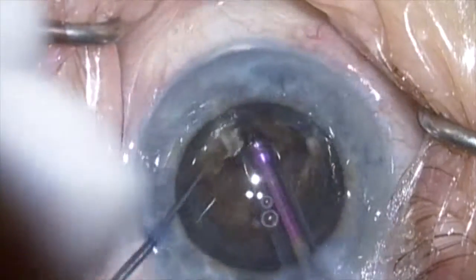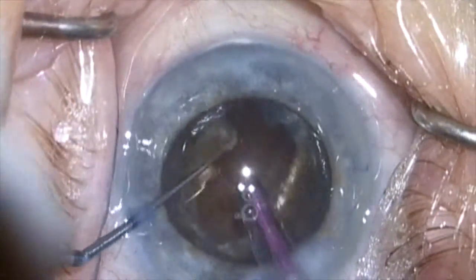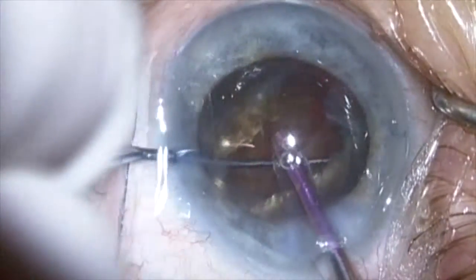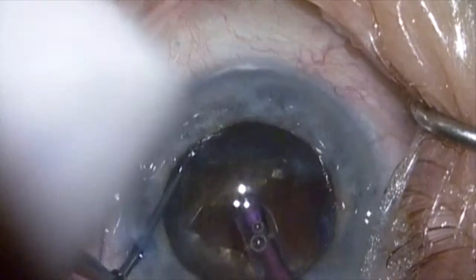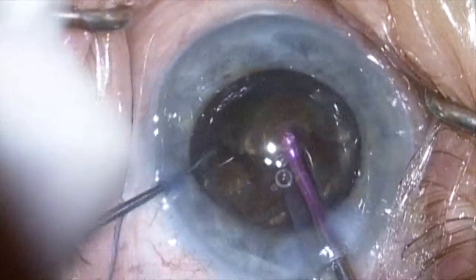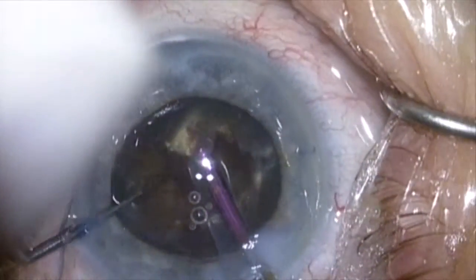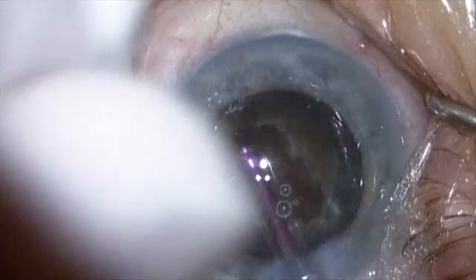I'm going to tear off a piece — hold the nucleus back and pull off a little piece and phaco that — and gradually keep working until I get to where I'm a bit more comfortable. The nice thing about creating a deep wide central groove is that I have more room to work and I can keep things away from the cornea endothelium. I can also see what I'm doing and see the red reflex. Again, this is a very leathery lens; pieces don't really crack off — they have to be torn off bit by bit.